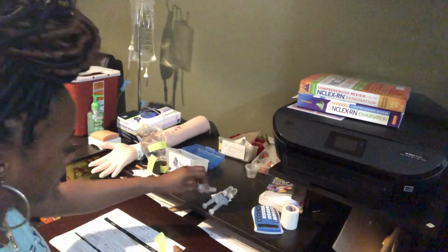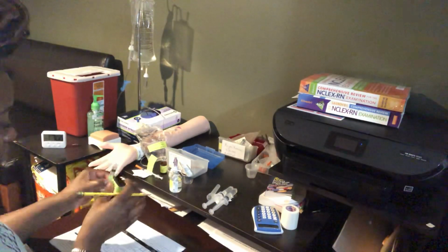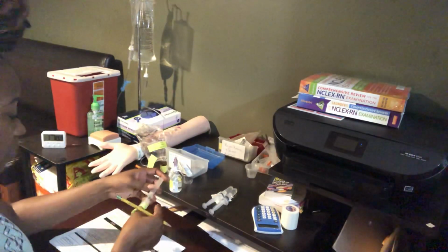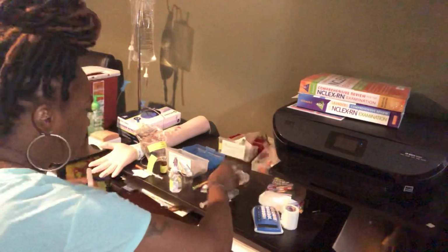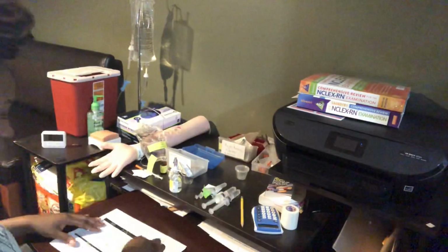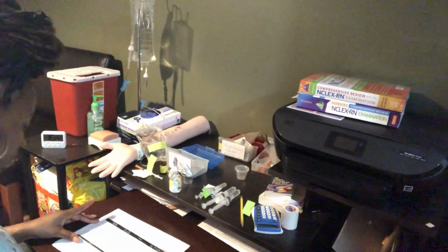And I'm going to put that on here. Show what I got. So now I got all my meds put. I'm going to need another alcohol wipe for this one. I'm going to clean the port also. So that's that. Now I put my meds back. I'm going to double check.